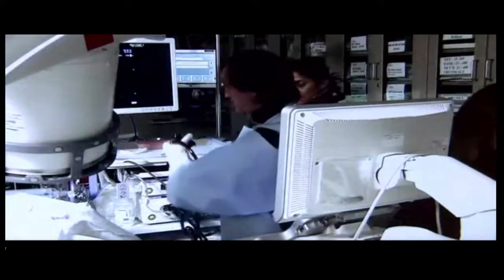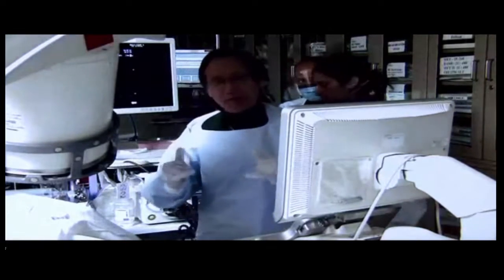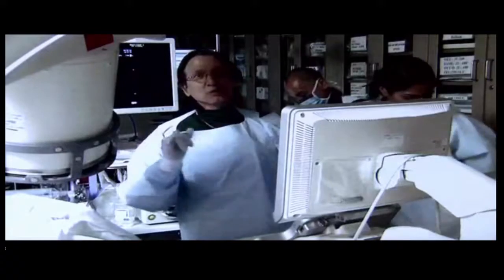So let me just tell you what our options are here. What I'm expecting, what I'm told, is that the PD is quite dilated, right? Correct. You want a forward view? You can use a forward view, sure, yeah. We'll use a forward view scope.